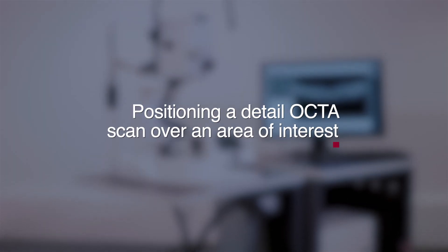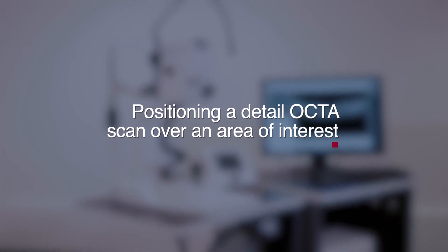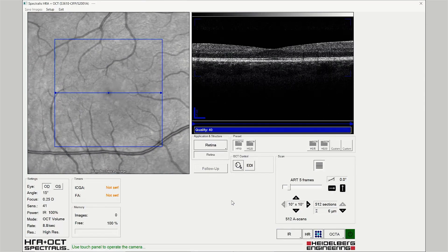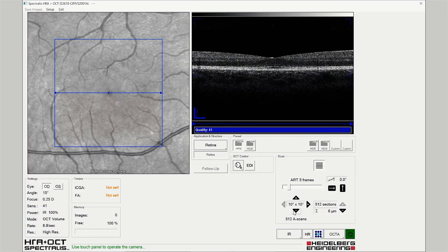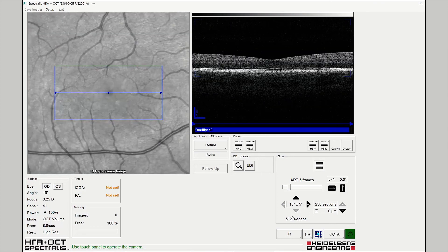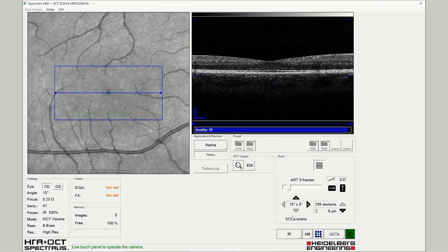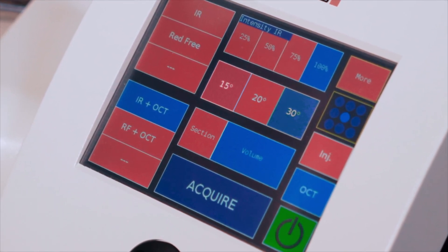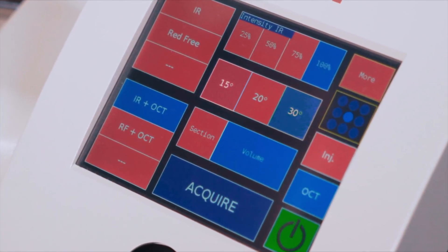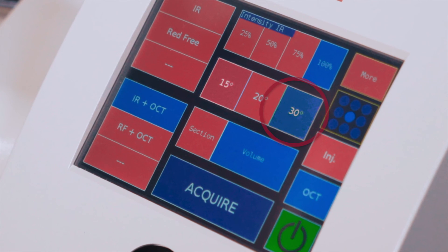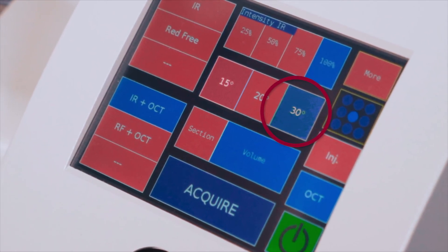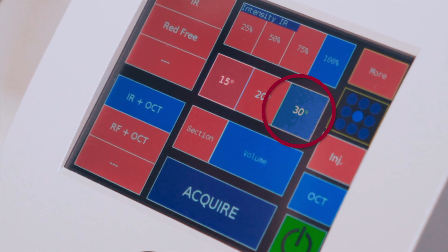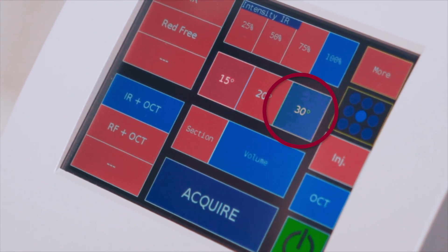Positioning a detailed OCTA scan over a region of interest. Open the high resolution 10 degree scan pattern and adjust the scan height to 5 degrees. The 15 degree fundus reference image provides a limited field of view. Selecting a 30 degree fundus image view will allow you to place your detail scan more easily over the region of interest.